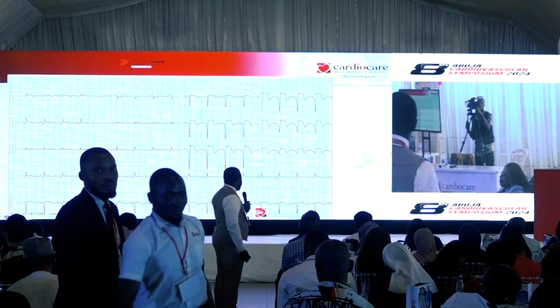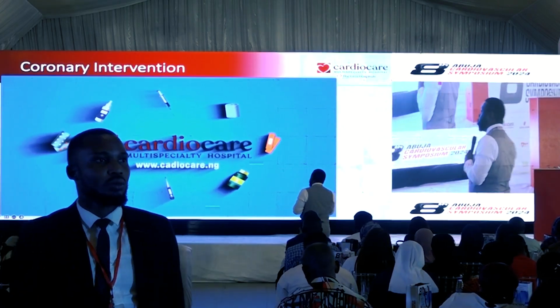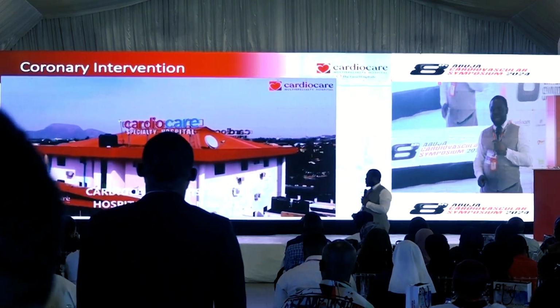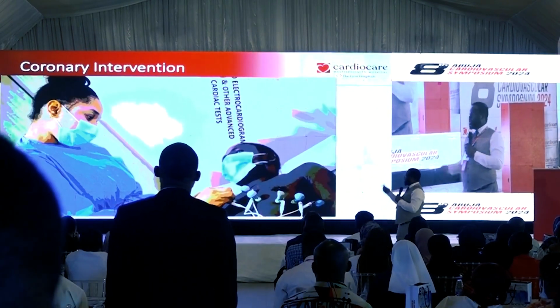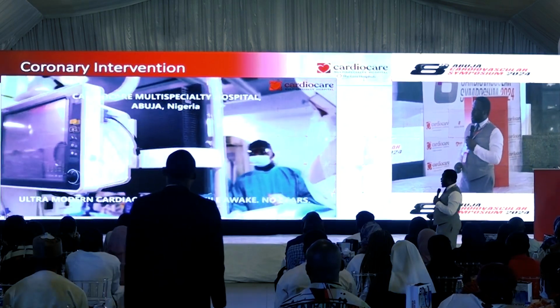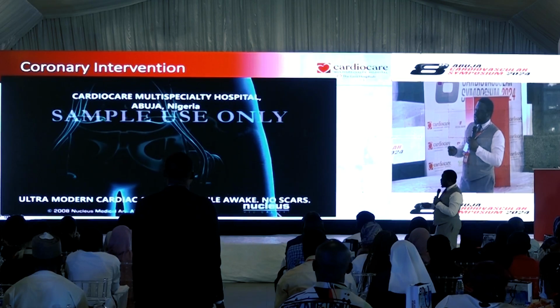Lateral, perfect. So you can see this is quite extensive. All right, so what do we do now in this kind of case? Having chest pain, standard 5 to 10 minutes, get into that CardioCare hospital, ECG, troponin, all that algorithm we talked about. Then we get into the cath lab, and then we pass our wire straight.